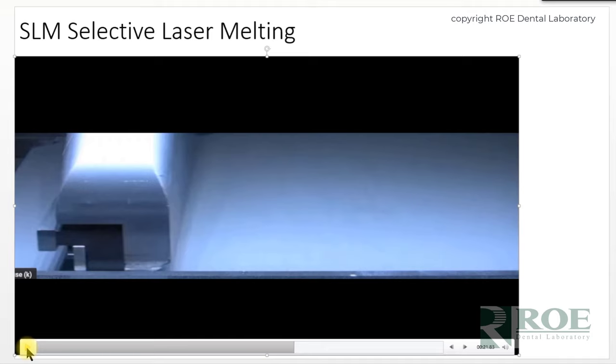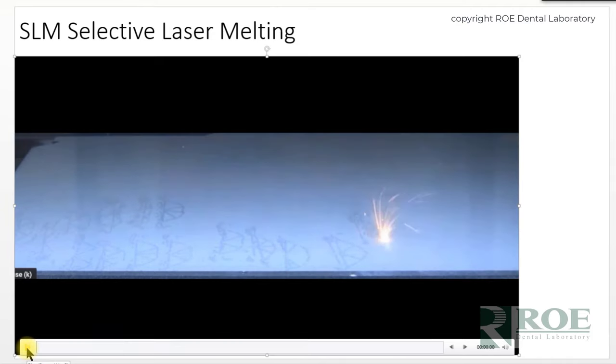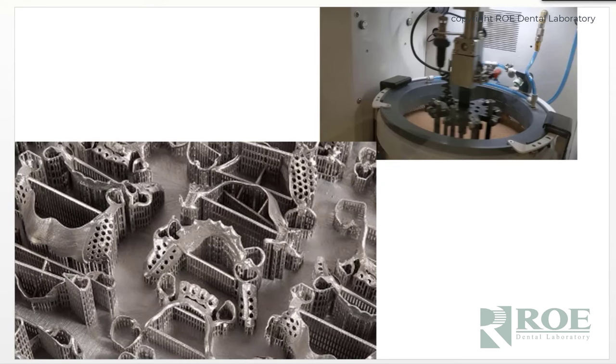When they invented SLM technology, it was a true digital-to-digital process. The file goes into software, gets nested on a platform, and then a laser hits the surface of a vat of chrome cobalt particles. It designs a platform and then a partial — the platform slowly sinks, the next layer of particles gets zapped by the laser, and incrementally, at the micron level, a partial gets built. There is no expansion, no warping, none of the heat and cold elements you have with traditional casting.